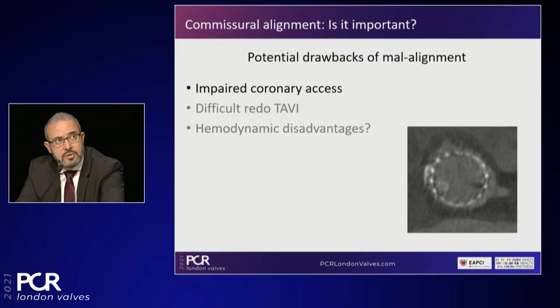We are focusing here today on the impairment of coronary access, but there are some other theoretical benefits of having the commissures aligned, which we may discuss in the next minutes as well. For example, the difficulty of doing a redo procedure, or maybe we have some hemodynamic disadvantages as well.